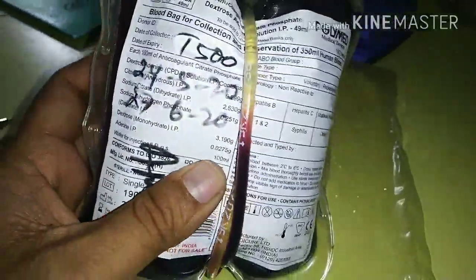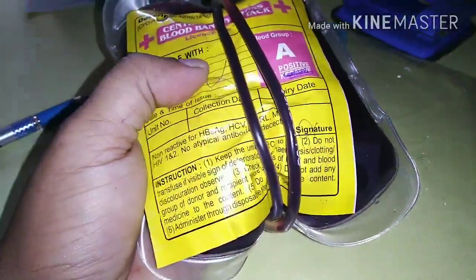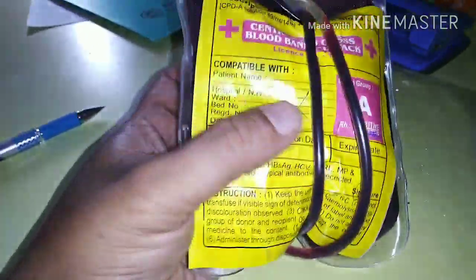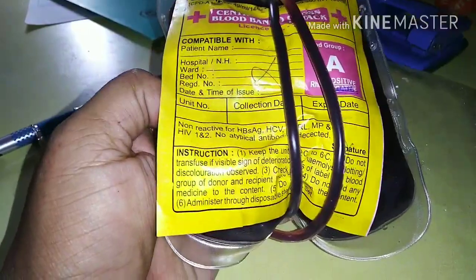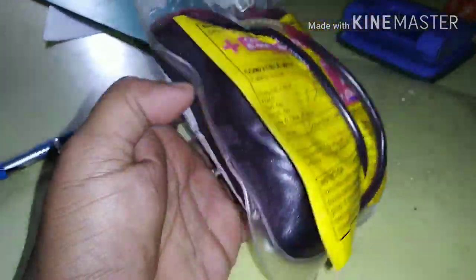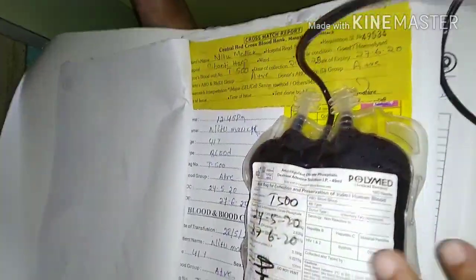Today we will learn how to do blood transfusion. This is a whole blood bag in my hand, which contains 350 ml of blood — whole blood. It comes with preservatives, and today we will learn how to use it.